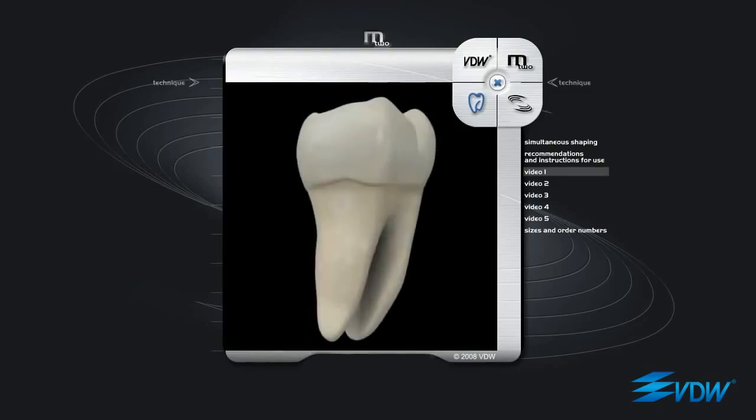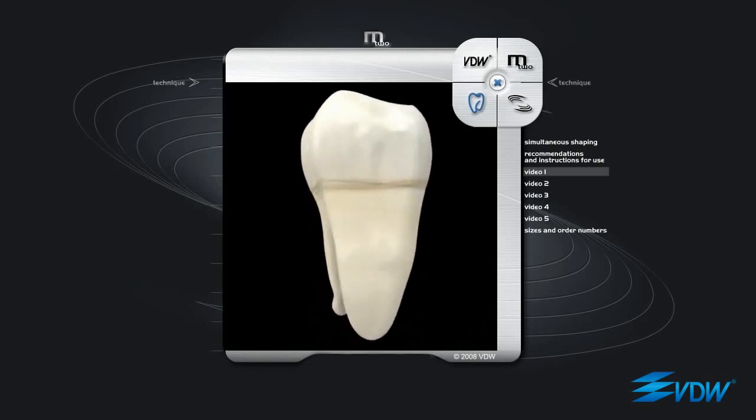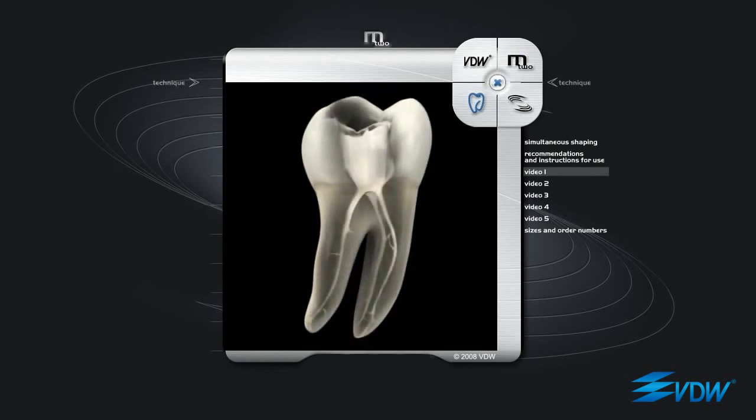Before commencing preparation with M2 instruments, patency of the root canal should be checked with hand instruments in ISO sizes 8 and 10. The first instrument to be used is M2 ISO 10 taper 04. It is inserted into the entrance of the root canal and rotation is started. Contact with the root canal walls makes the instrument progress naturally in increments of 1 mm. In narrow or strongly curved canals, progression can be slowed down to prevent stressing the instrument. In this case, passive filing is recommended before continuing with natural incremental progression. If progression slows again, passive filing should be repeated, alternating with natural incremental progression until the apex is reached.